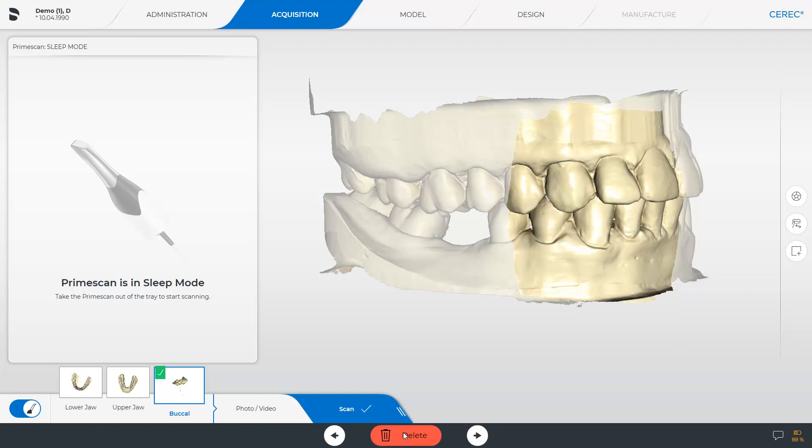Make sure that the scanned area is sufficiently large and contains all areas needed to support the guide. The guide can never be larger than the scan area. A smaller guide can be generated later in the design phase. It is also important that there are no scan gaps in the support area of the guide; otherwise, the guide cannot be calculated. The green check mark indicates that the buccal scan has been successfully performed.